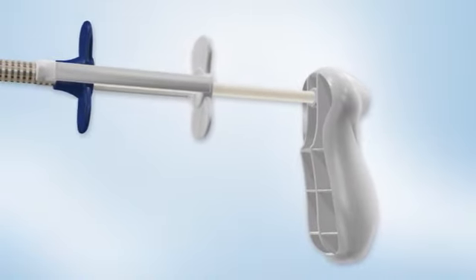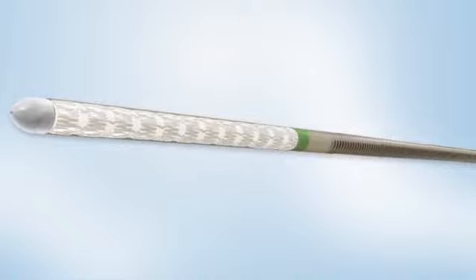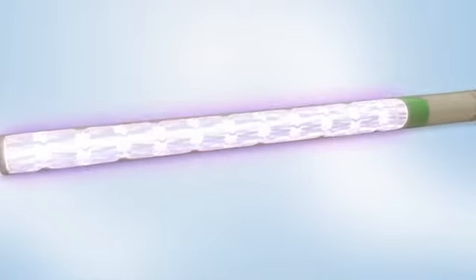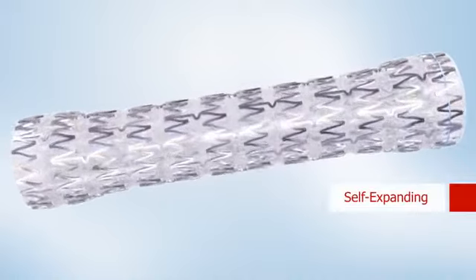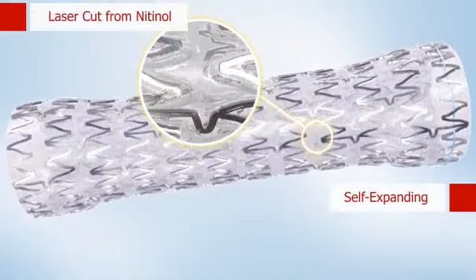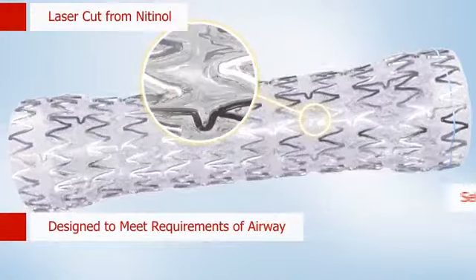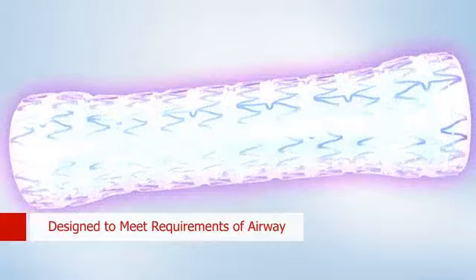The Arrow Tracheobronchial Stent System is comprised of a dedicated delivery system and a radiopaque tracheobronchial stent. The Arrow is a self-expanding stent laser cut from Nitinol and designed to meet the specific anatomical requirements of the airway.